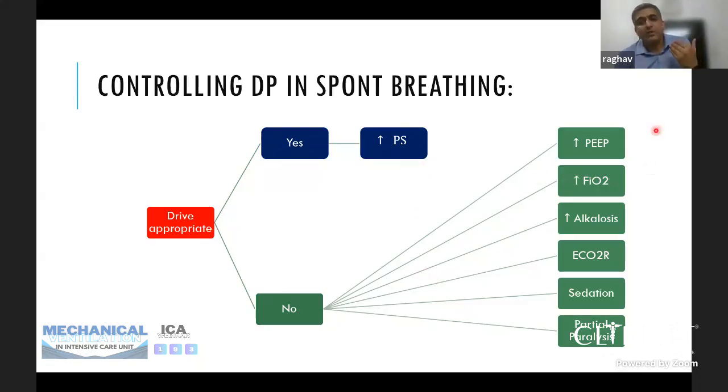If this is not helping, you can try increasing the PEEP, or increasing the FiO2, which will improve oxygenation and decrease the respiratory drive. Try producing some alkalosis by giving soda bicarb, or if these don't work, increasing the sedation or trying partial paralysis.